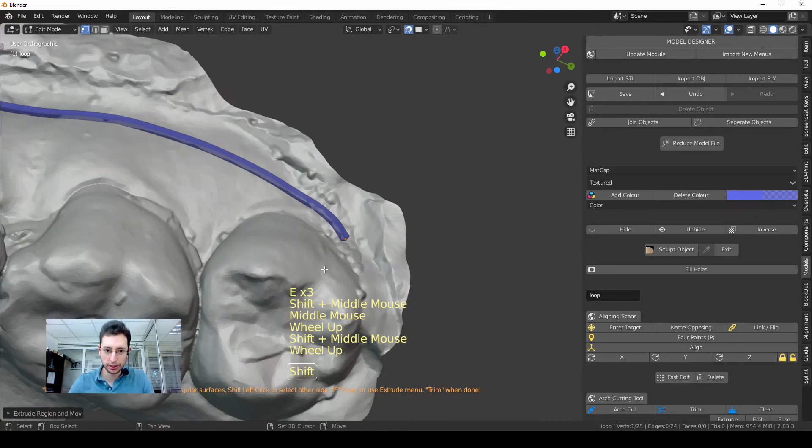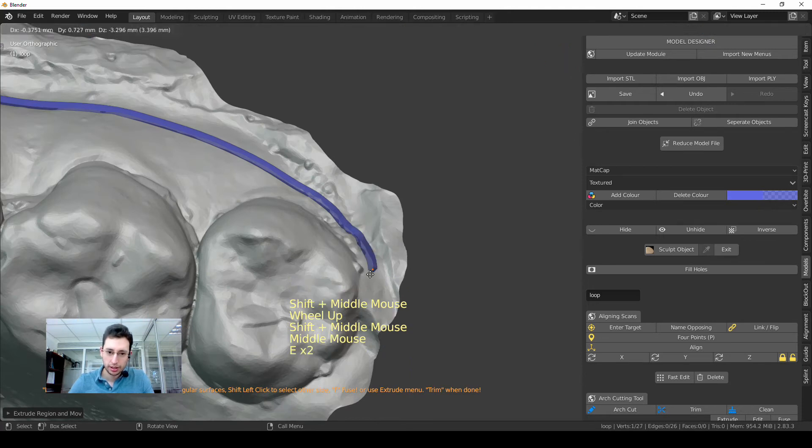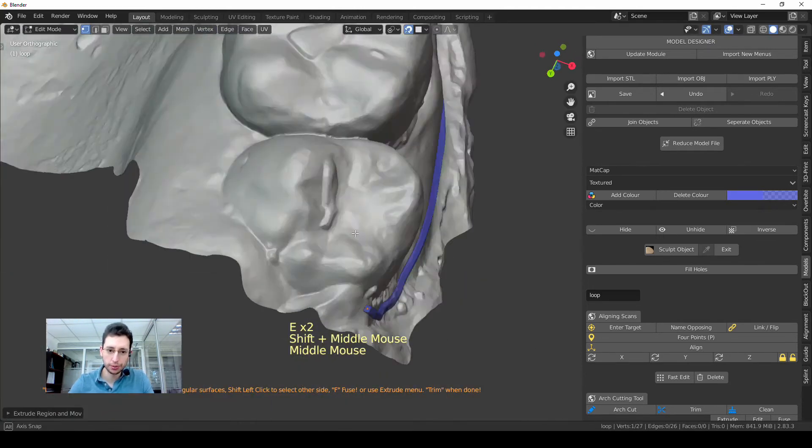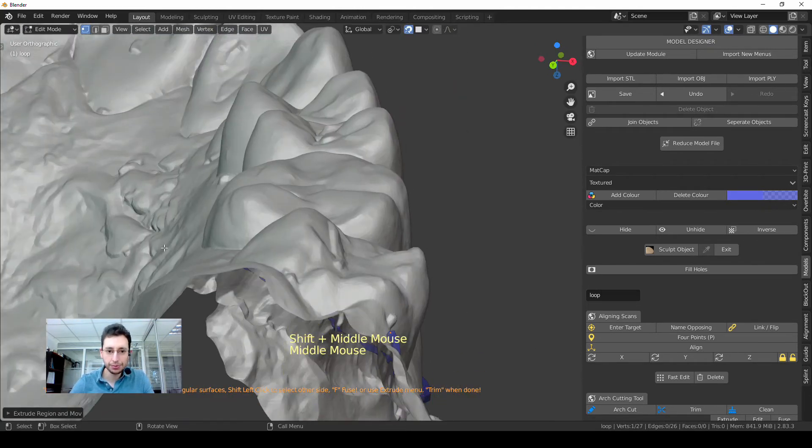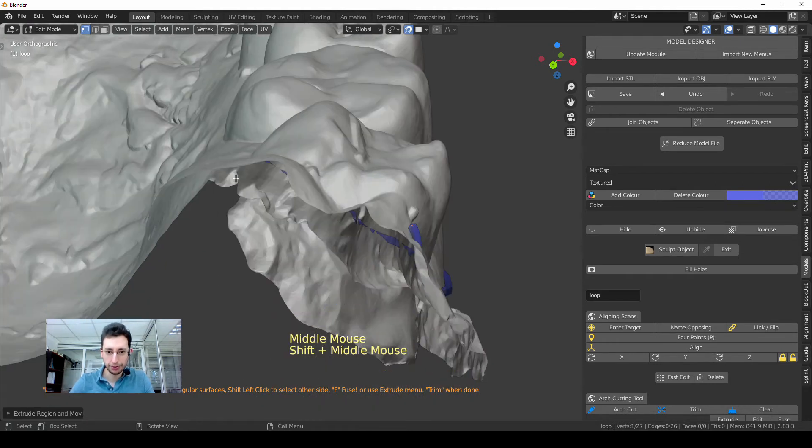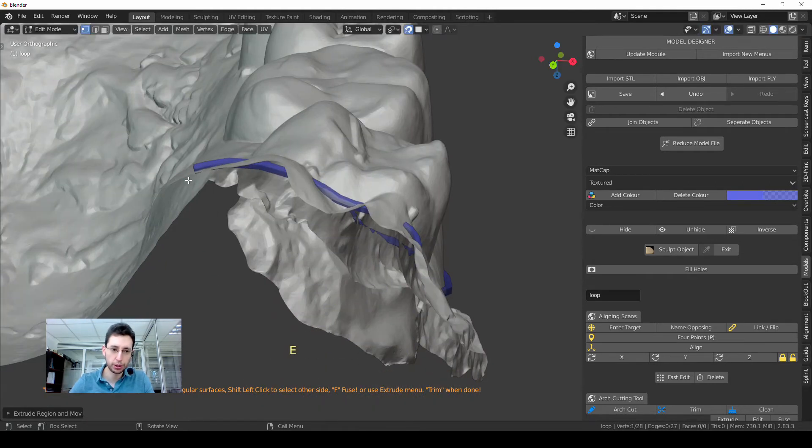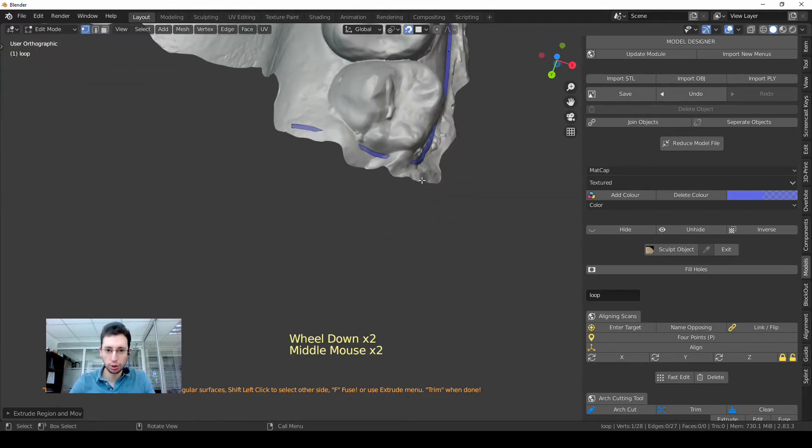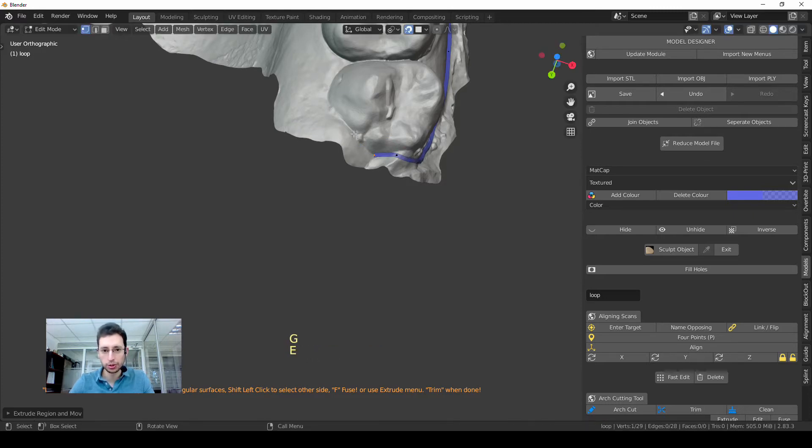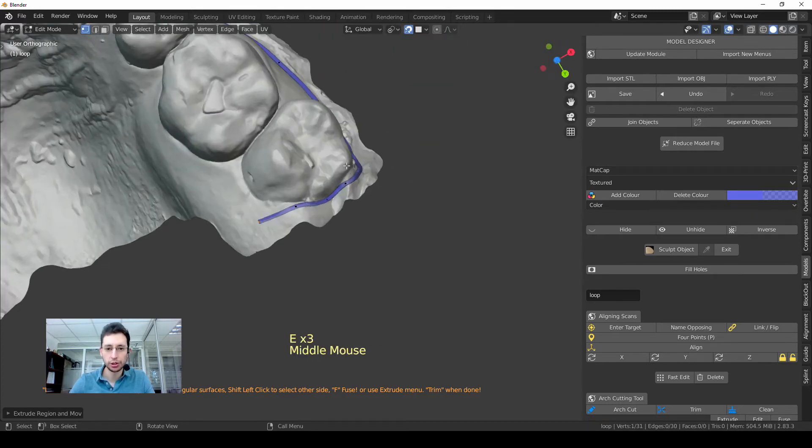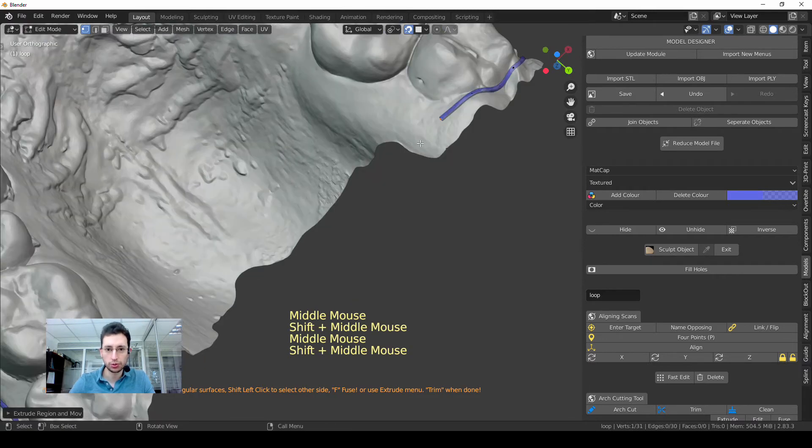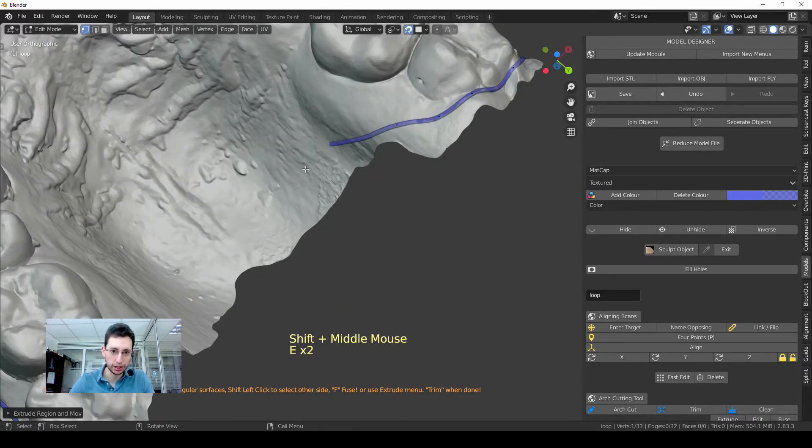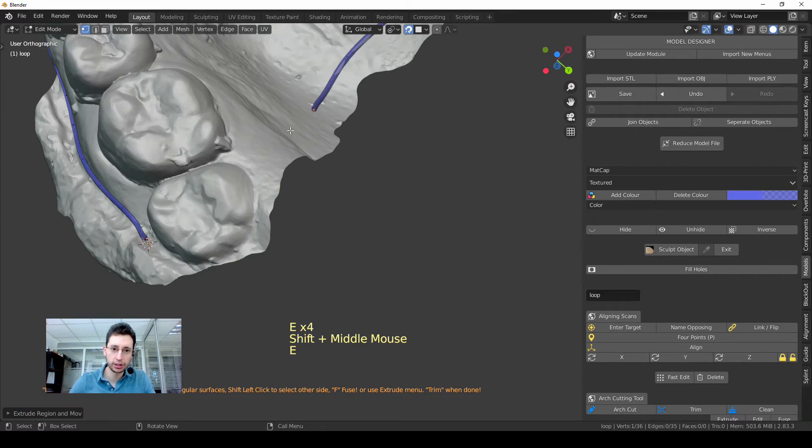This can happen because the shape of the model is like so. If I, for example, put my point here, my vertex there, this tube is going to go through the model and that's wrong. You have to follow the surface in order for this tool to work properly.